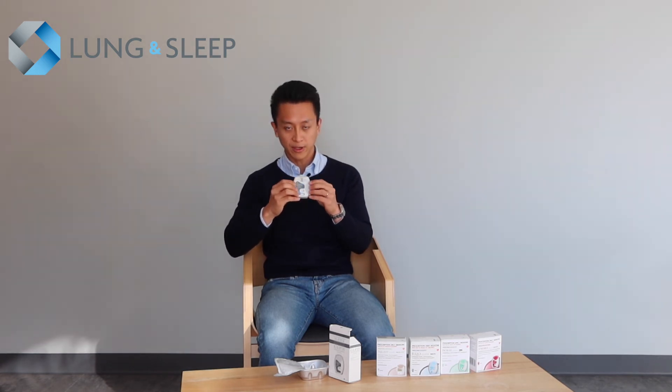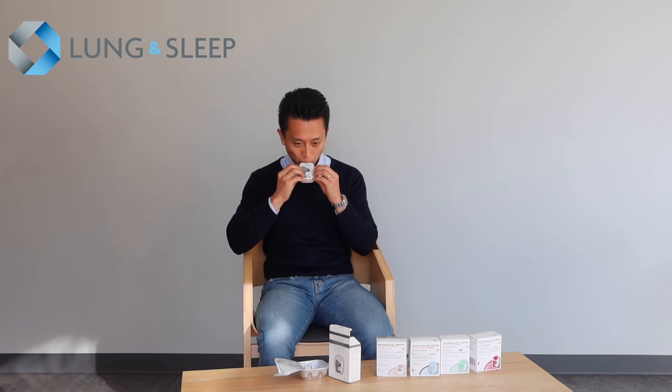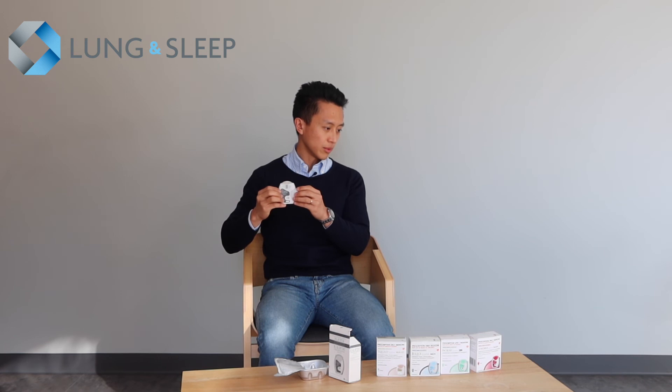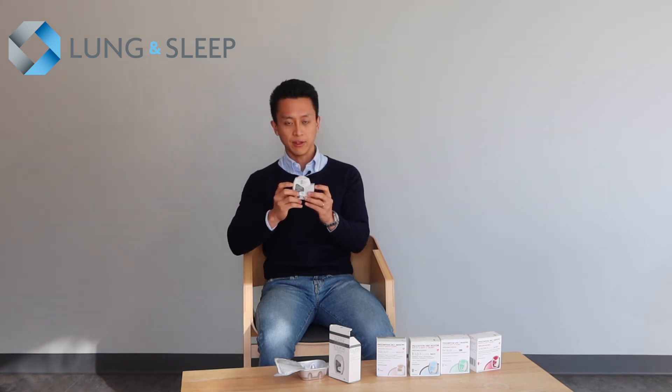First exhale, then put your lips around the nozzle. Take your breath in, hold, then exhale. Flip the lid back on and you're done.